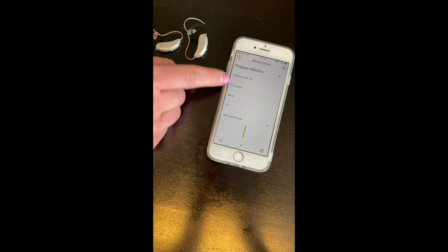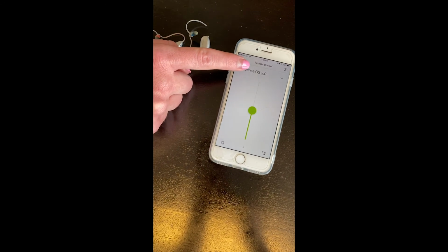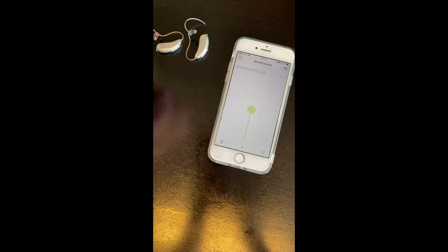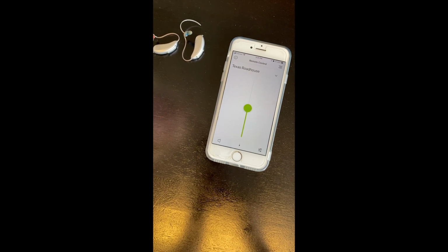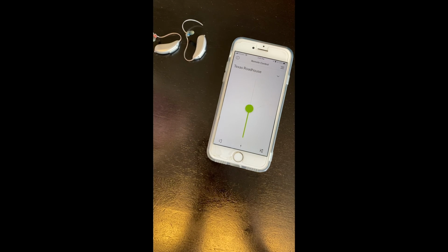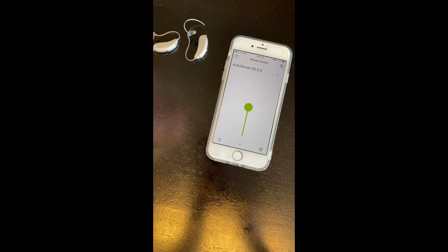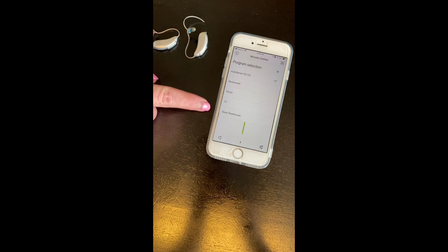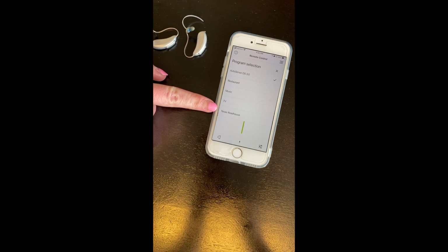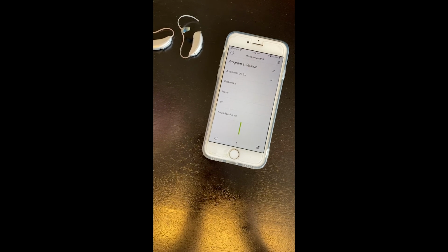Let's say we went home, we could always change it back to AutoSense, but the next time you're at Texas Roadhouse, you can click on this, and then you can click on Texas Roadhouse, and it'll take you back to those same settings that you already had before that you liked at that restaurant. If you came in for an adjustment though, your provider would adjust some things, and any program that you made yourself, like this Texas Roadhouse, will disappear, and you can just remake it again later.